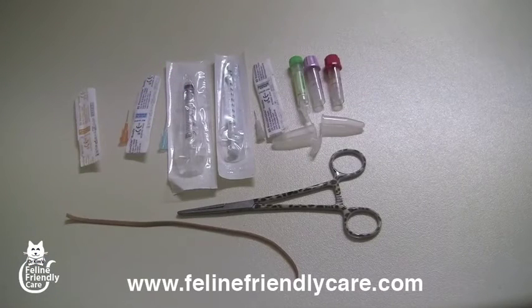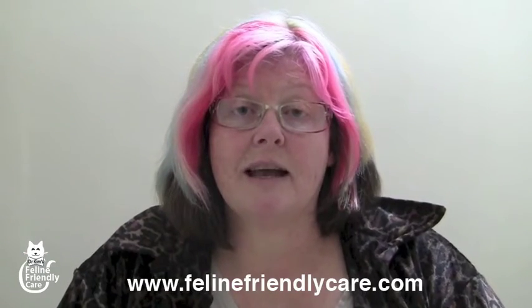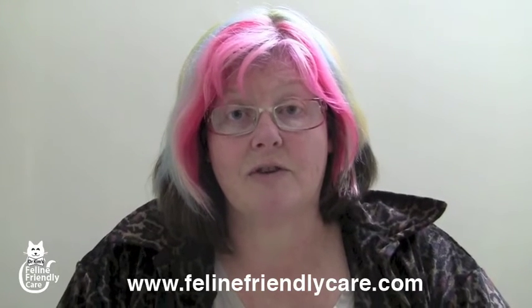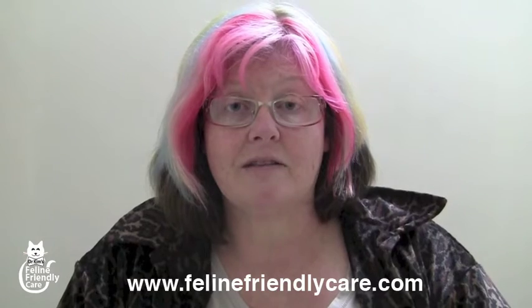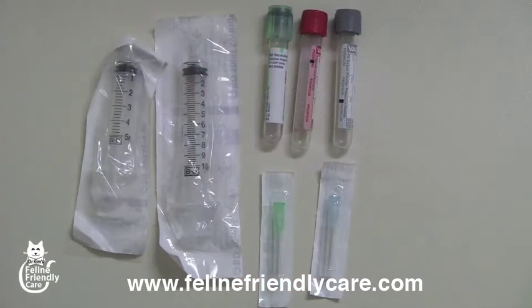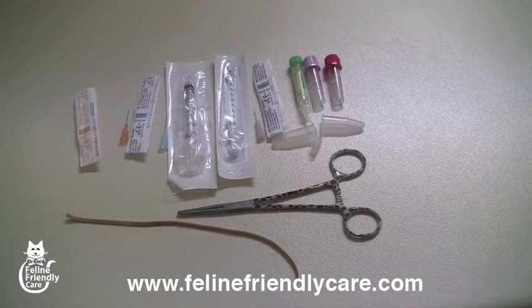This is the feline-friendly way of getting blood. It's the same as getting blood out of a neonate. There just isn't much there. The blood pressure's lower and the veins and so forth are smaller. So rather than be driven by the supply requirements of the laboratory sending you their sample tubes, if you request that you get appropriately sized tubes for the cats, then you can modify your technique so that it's feline friendly, effective and much clearer results.